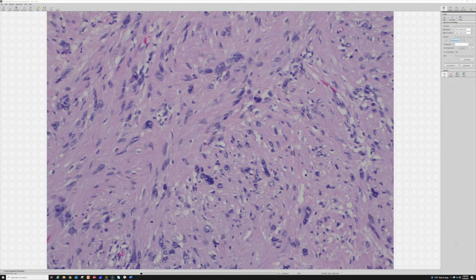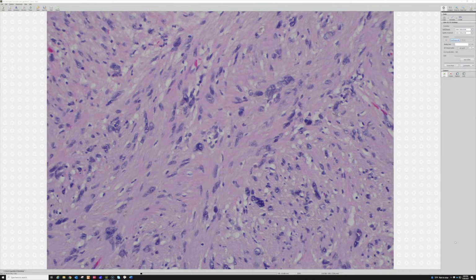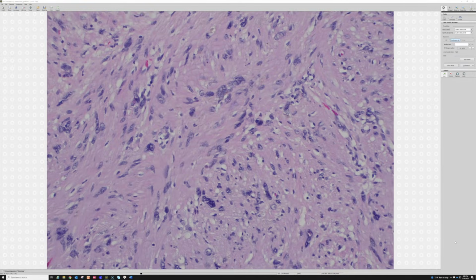I do think those retroperitoneal ones probably tend to be there longer because they grow bigger before they cause symptoms. And then they have been sitting around and bleeding into themselves. So it does make sense they get some change. But you can see scattered pleomorphism, this degenerative, hyperchromatic, smudgy pleomorphism in any schwannoma.